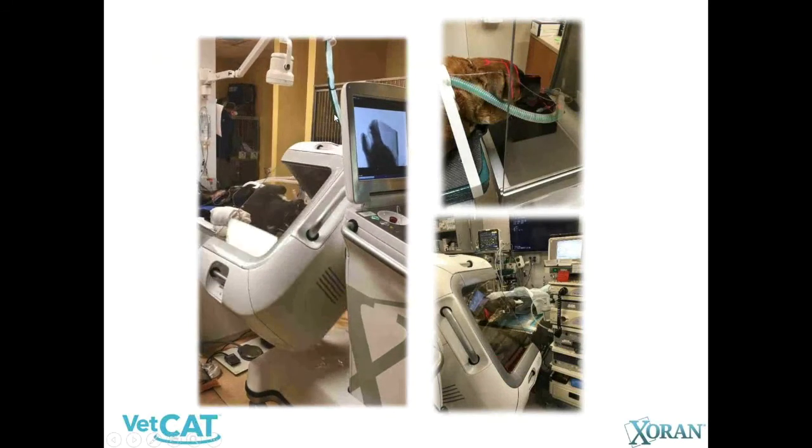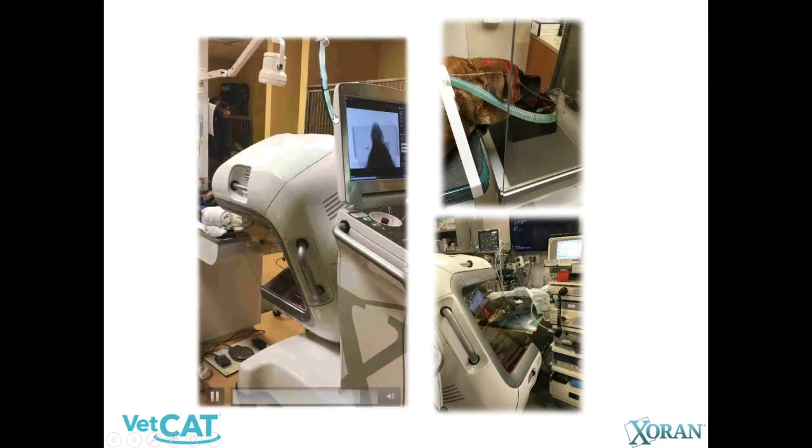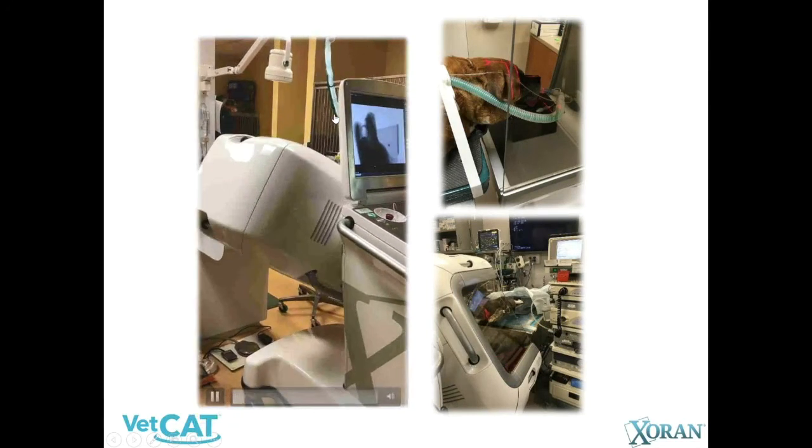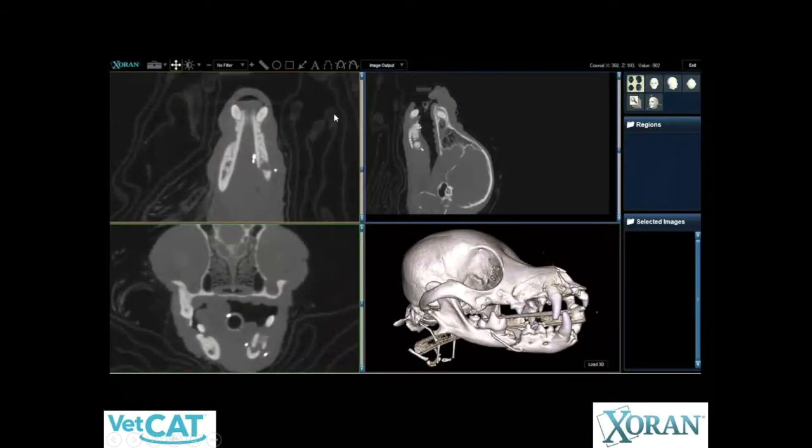Just quickly, the VetCAT CT scan is a cone beam CT. It rotates around the patient. Just one rotation takes about 30 seconds. And then once the images are acquired, the screen comes up, and there are various areas, various cuts of the patient, as you can see here on the screen.